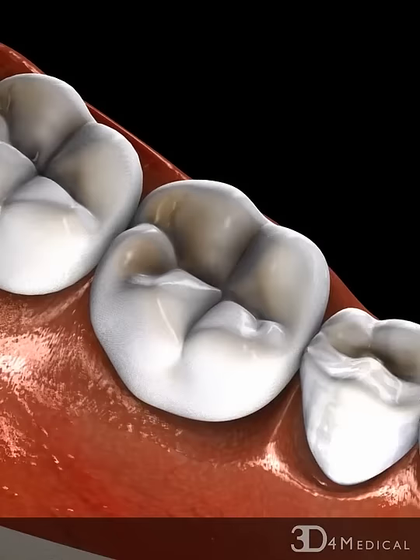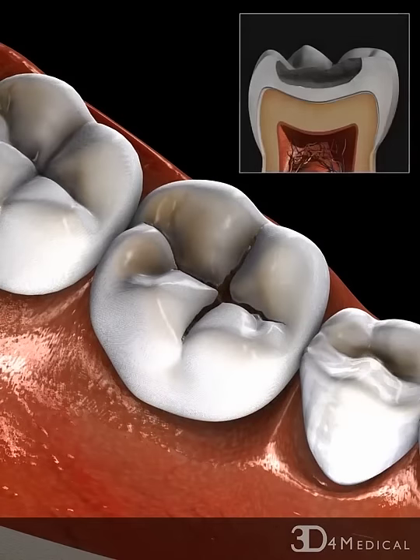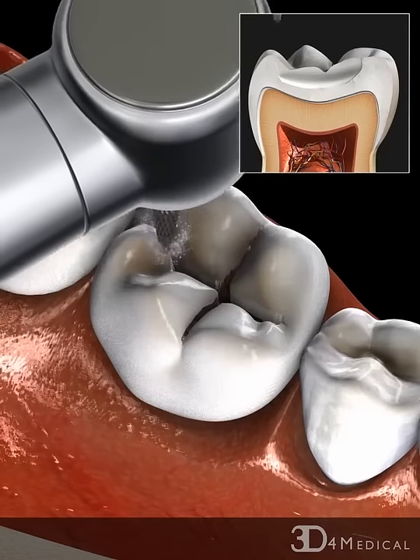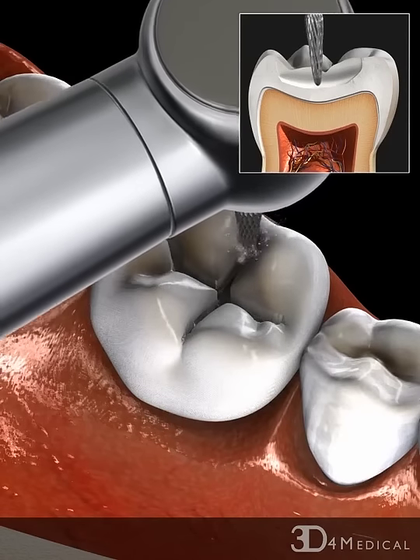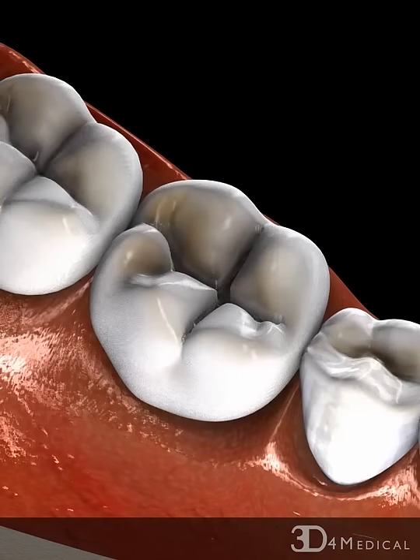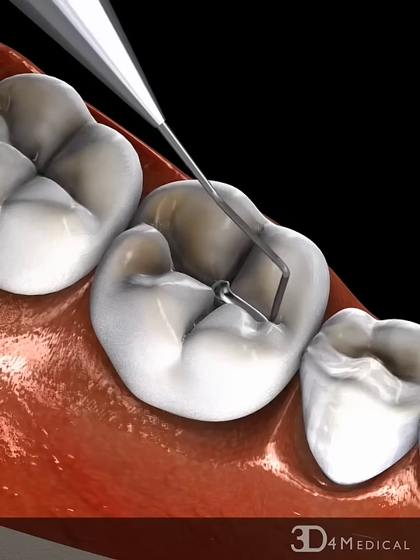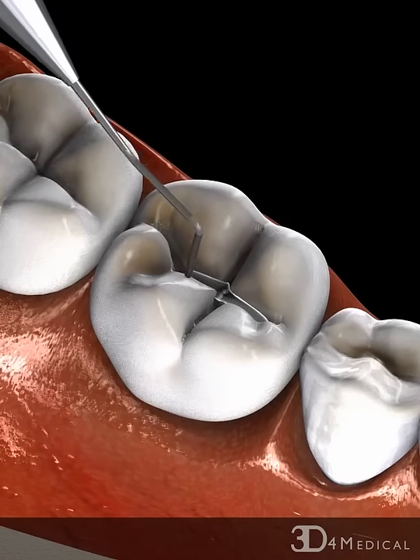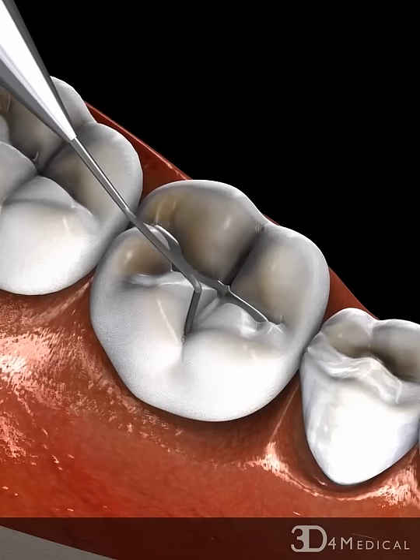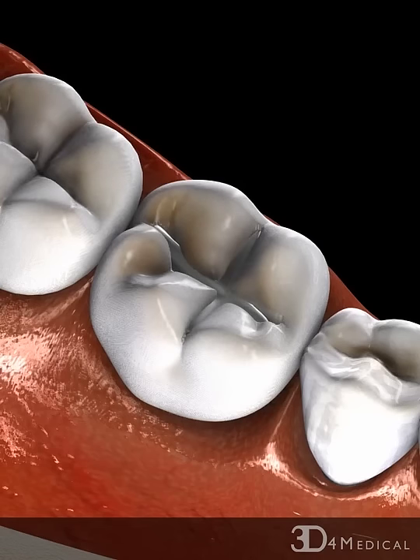When tooth decay occurs on the biting surface of a tooth, a dental drill may be used to remove the affected area. Then a metal alloy called amalgam is pressed down into the drilled area and pushed out to fill all the crevices.